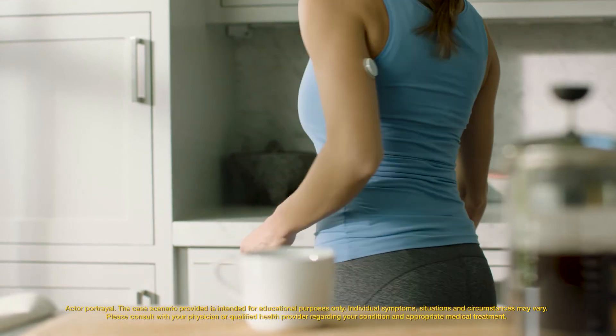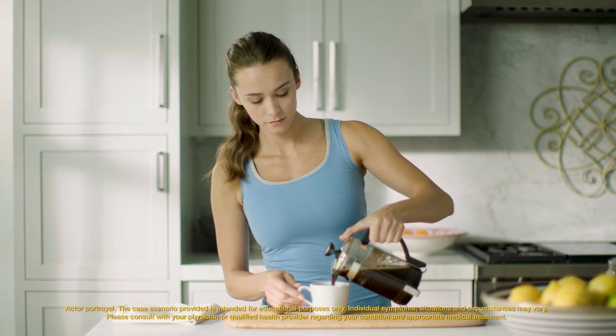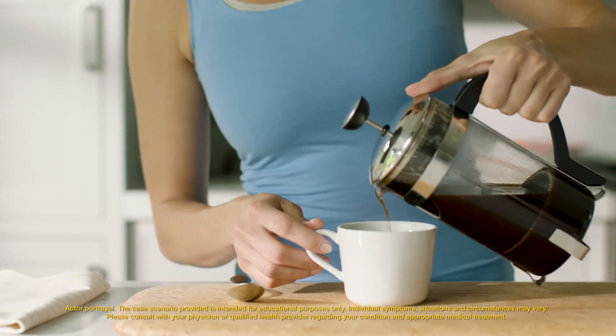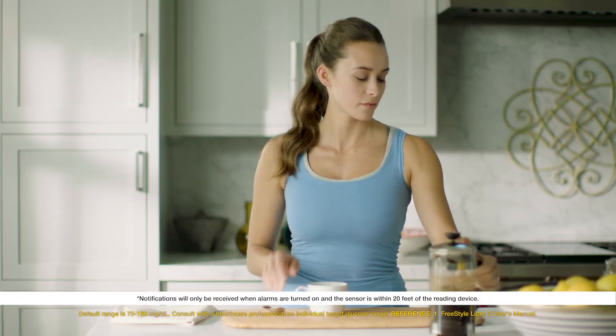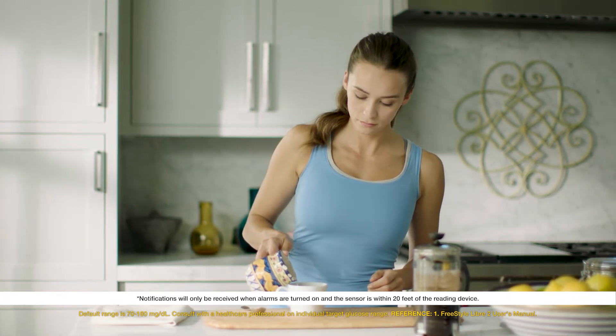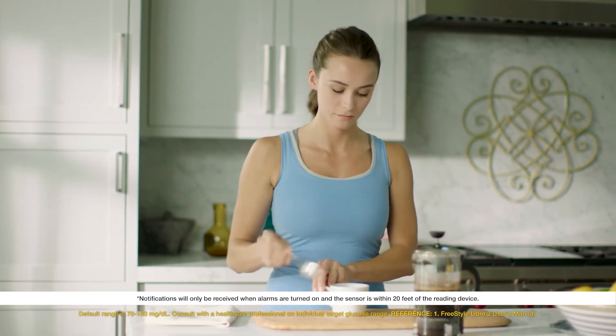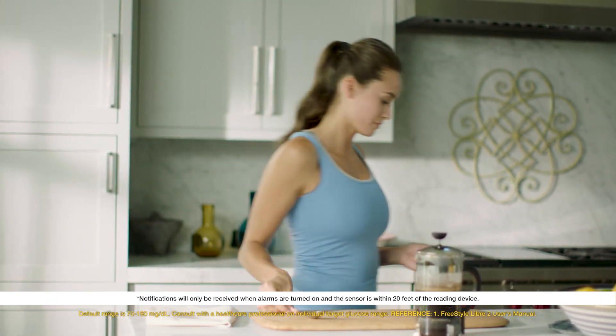I enjoy living an active, healthy lifestyle, but as anyone with diabetes knows, managing my glucose levels can still be a challenge. I love that my Freestyle Libre 2 system gives me real-time optional glucose alarms without scanning. Alarms trigger when my glucose readings cross the levels I've set, letting me know when my glucose is too high or too low.